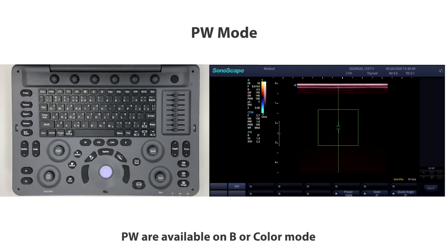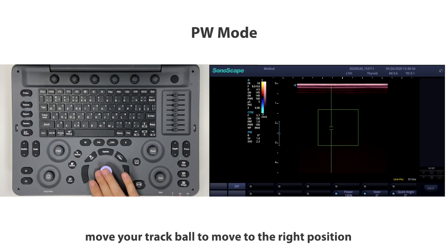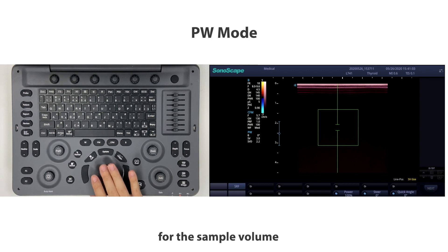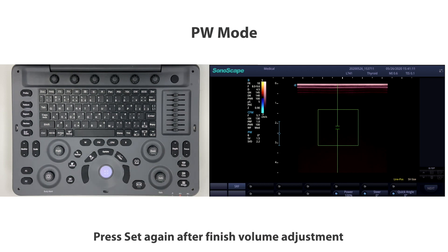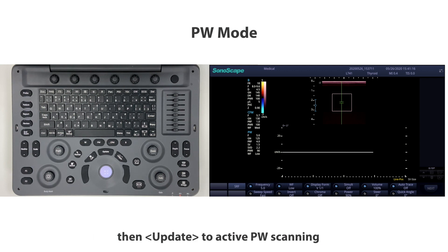Press the PW button to enter PW mode. PW is available in B or color mode. The sample volume appears in the center of the image — move the trackball to the right position, then press Set to activate size adjustment for the sample volume. Move the trackball again to adjust the volume size.